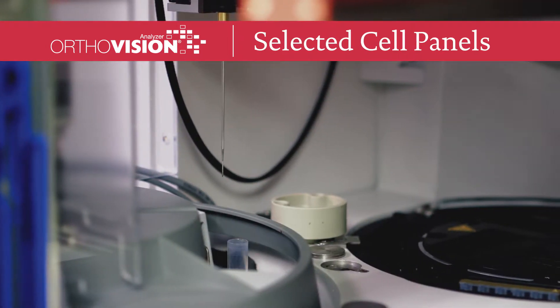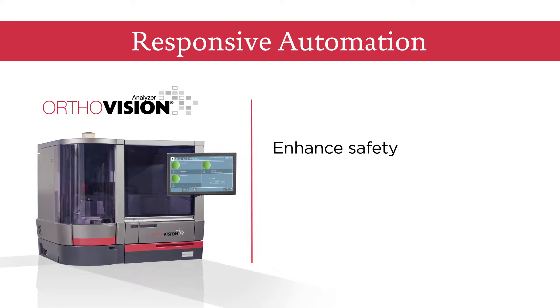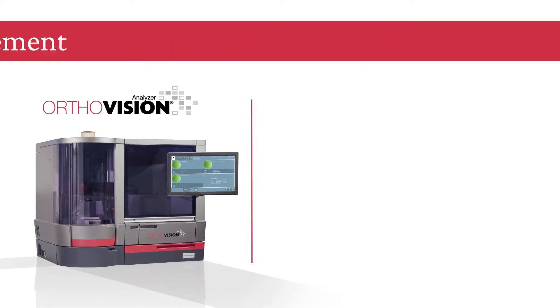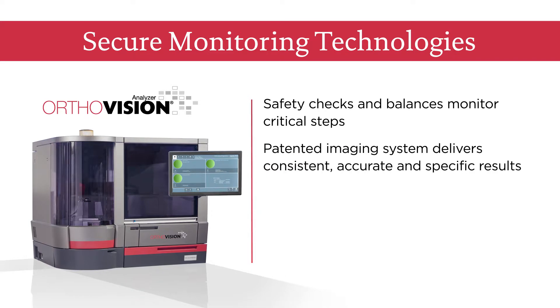All on the same instrument. The OrthoVision Analyzer is the first ever system with responsive automation designed to enhance safety and establish critical efficiencies, utilizing dynamic workflow management and secure monitoring technologies.